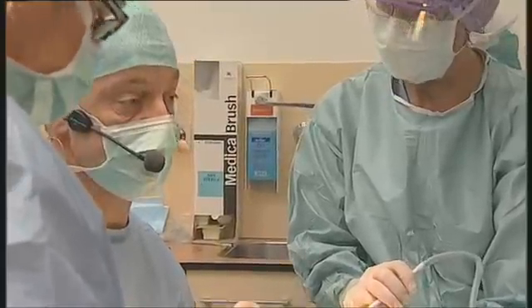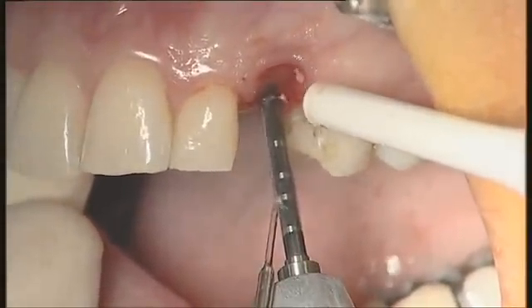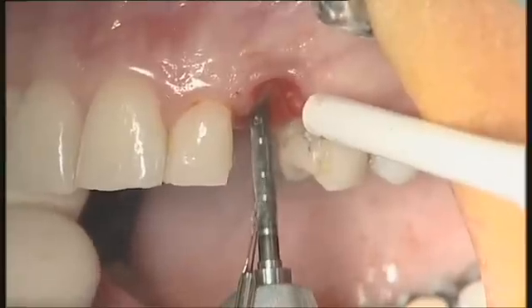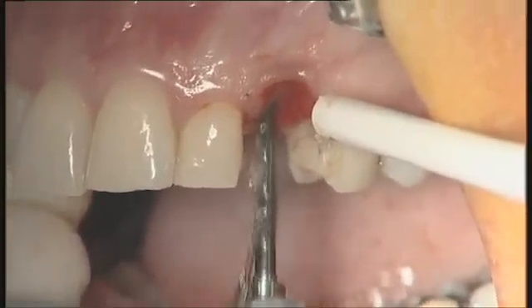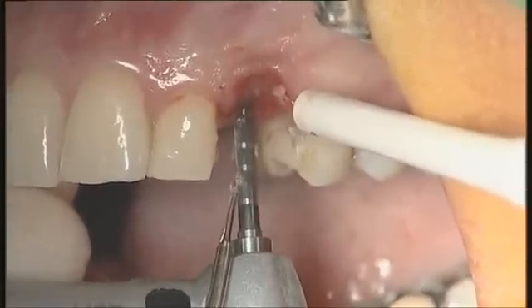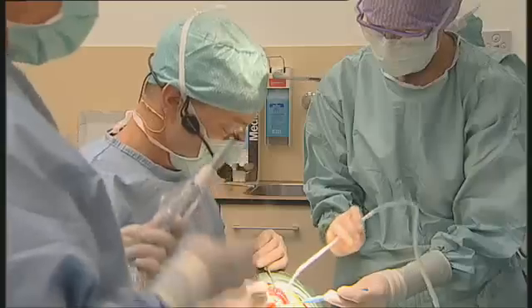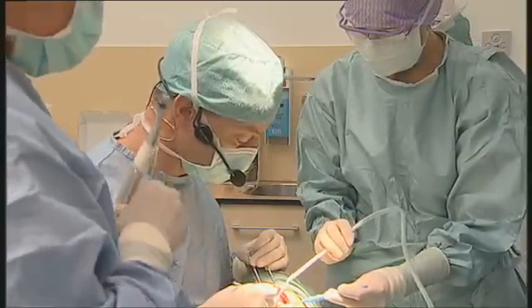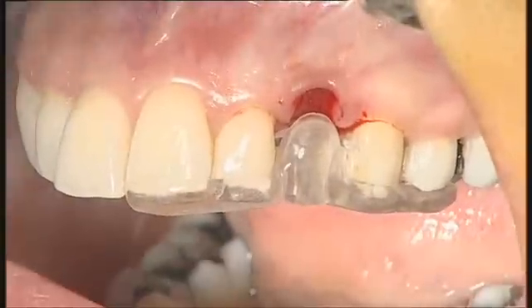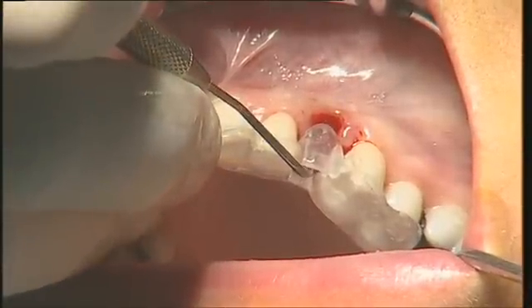We will enter the palatal wall just like this, and then slightly and slowly correct the orientation of the drill. Sounding of the bone — everything is perfect. We will check with the surgical guide if it is okay, and verify the direction is good. That's okay.